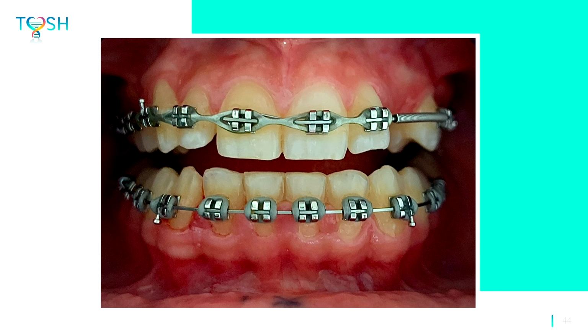So let's look at some case studies. So this young lady, her name is Grace, and she was so fabulous, she let me take pictures and videos to use for educational purposes. So Grace had shared that she had recently been to the orthodontist and that she felt like her gums were pretty swollen, but the orthodontist wasn't too concerned about it, and so she thought that must just be normal with braces. And so I said, well, I don't really think it is, but let's go ahead and take a slide and let's clean your teeth and let's just do all the things. So that's what we did.